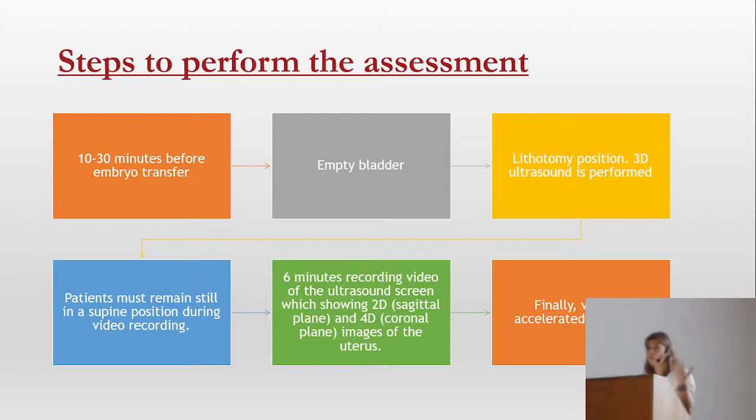I've seen other groups doing uterine peristalsis, and they have a huge problem: you cannot stand like this with nothing here, without moving. So this is one of the techniques that we developed so that we are not moving. Anyway, sometimes the patient can cough.